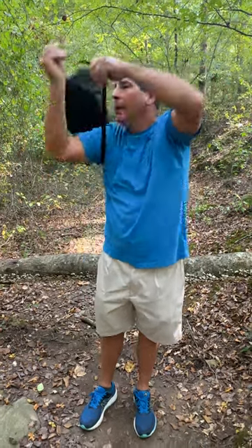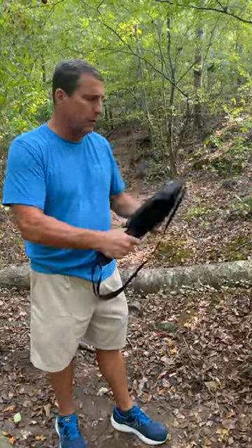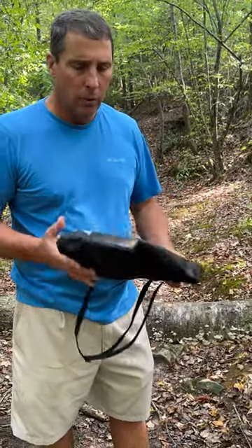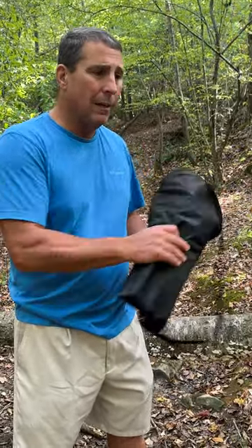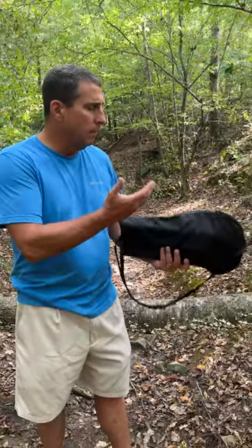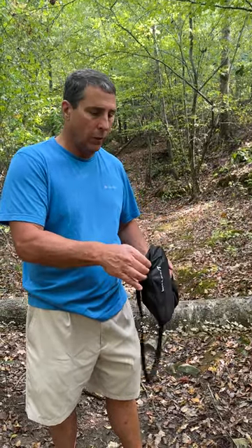It's got an adjustable shoulder strap on it so it'll fit most anybody. So we're going to take it out of the carrying case. You can see right here it's lightweight and portable — weighs 1.7 pounds, 17 inches, it's compact. You can put it in your car, in travel luggage, have it conveniently in your home without taking up a lot of space. That makes it more likely you're going to want to grab it and take it with you on your outings and ventures.